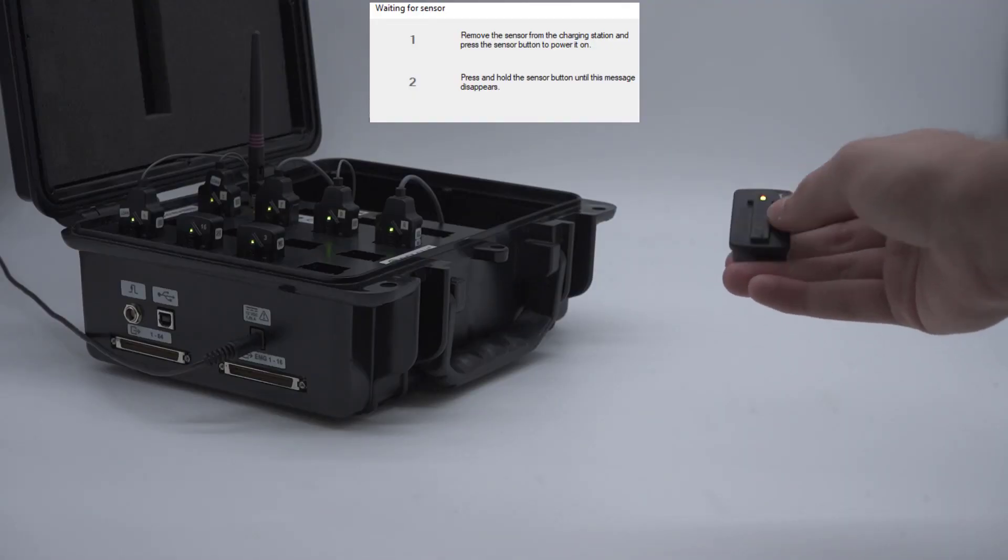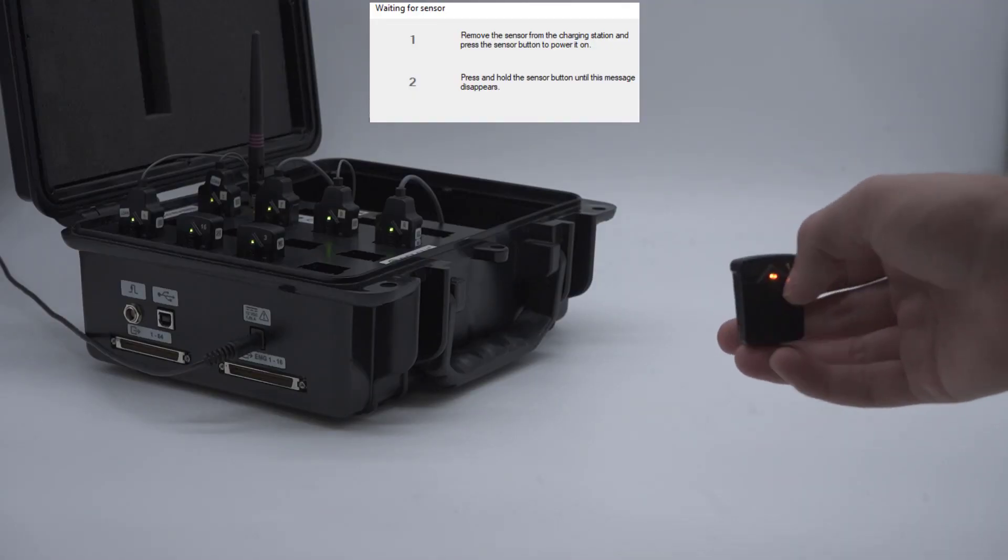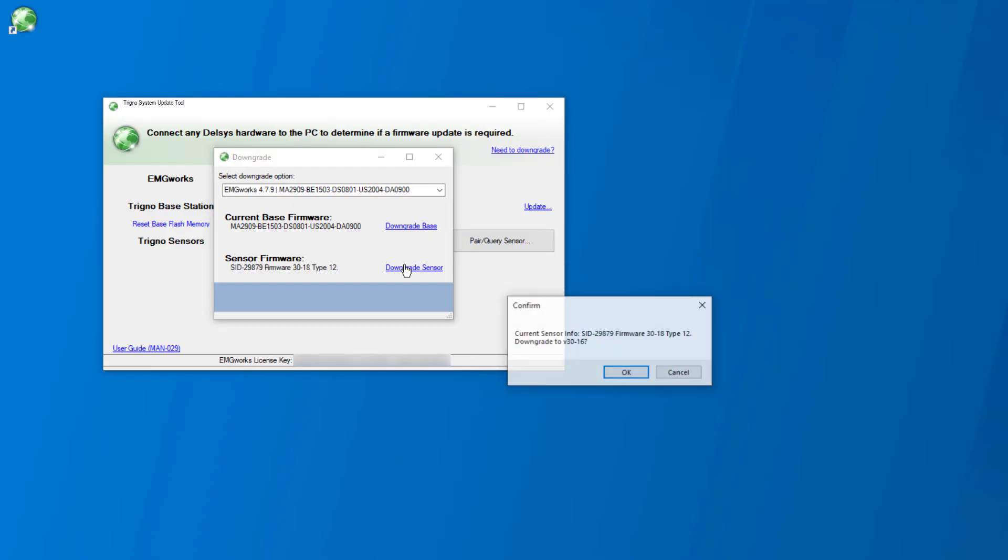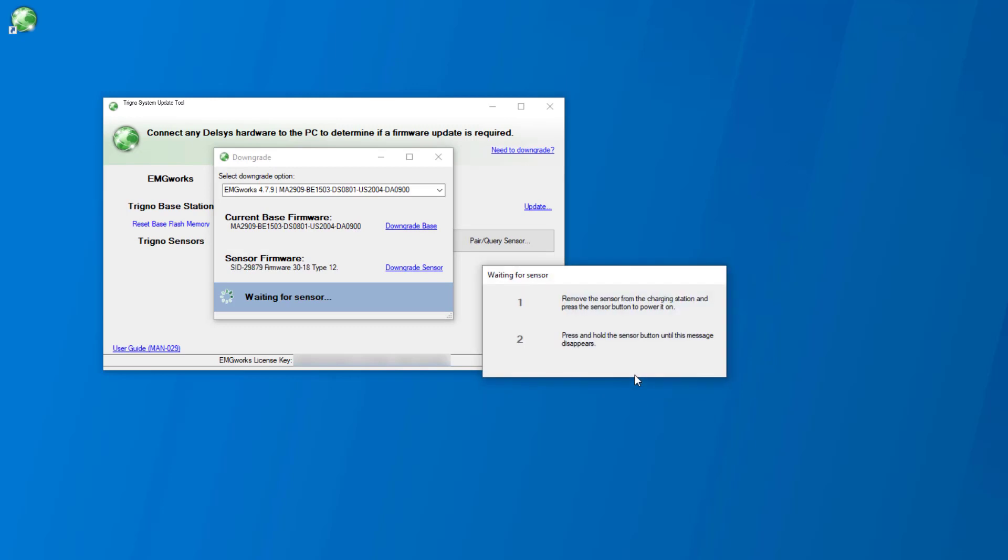Follow step two by holding the sensor button down until the prompt disappears. Select OK on the confirmation prompt. Skip step one of the on-screen prompt if the sensor is flashing between green and amber. The status will appear at the bottom of the downgrade window.